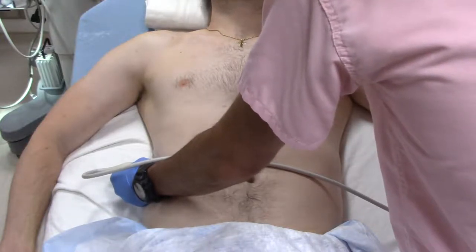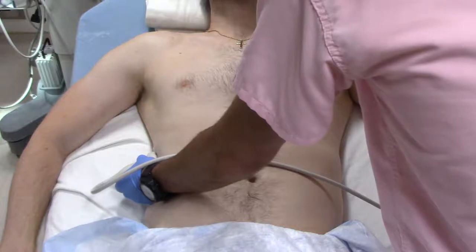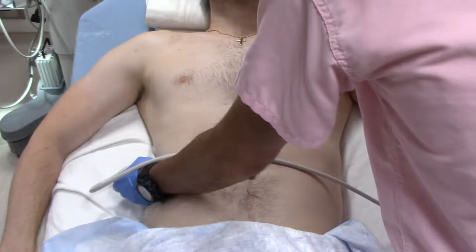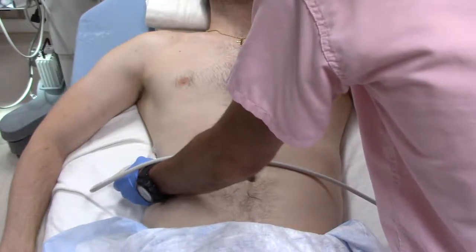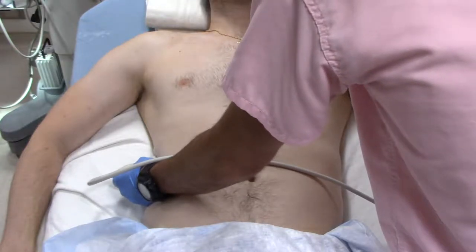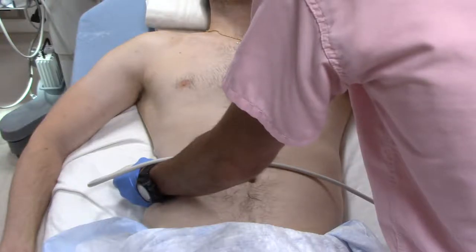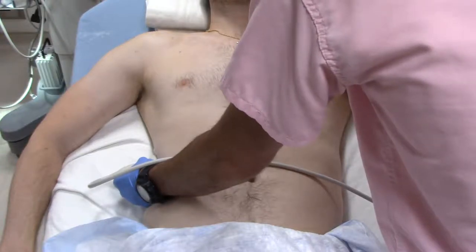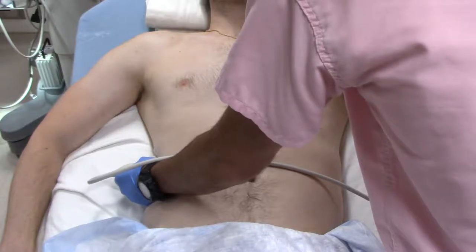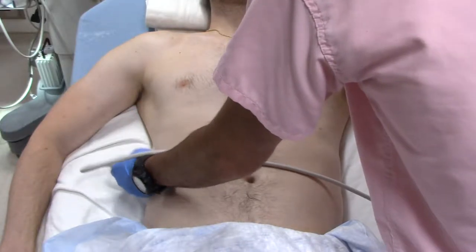The next clip we're going to get is up into the chest. We're going to angle just a little bit up towards the patient's head. We're going to see a bright white line on the left side of our screen — that's going to be our diaphragm. We're going to look for fluid behind that and acquire that clip as well, doing a little bit of fanning to make sure there's nothing black back there.